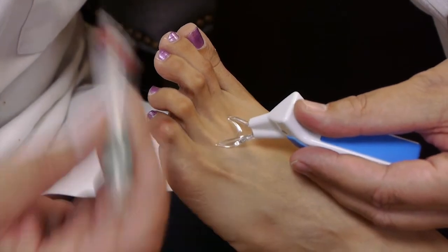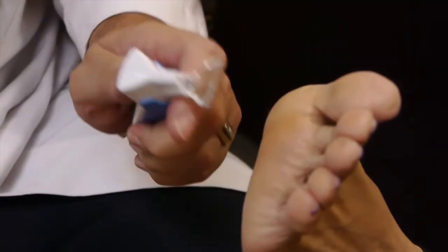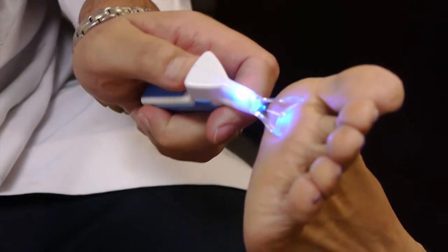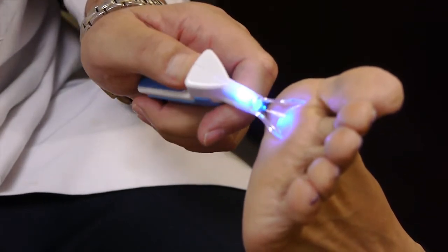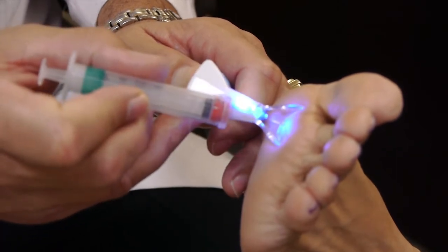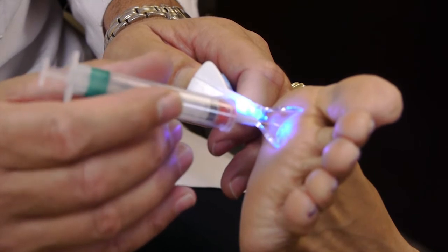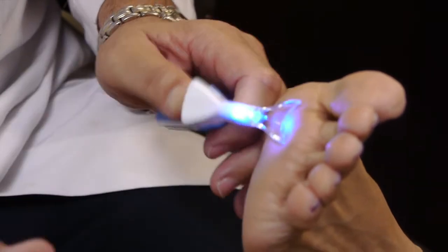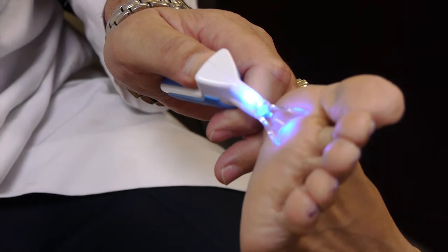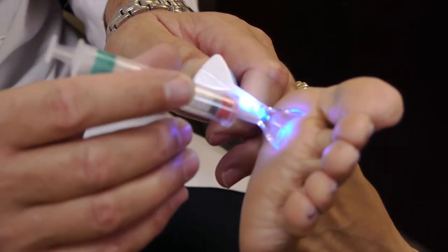If the neuroma is done on the plantar aspect injection, it would be the same thing, just putting the device directly on the plantar aspect of the foot. Now, let's say that this patient had a wart. What I've done in the past is I use the device on the plantar aspect of the foot, and I put the needle directly into the wart, and I infiltrate the numbing medication so that I can address it, just like this. And the harder I push, the less they feel, without obviously pushing too hard, and I can put it right in there like this, right on the spot.